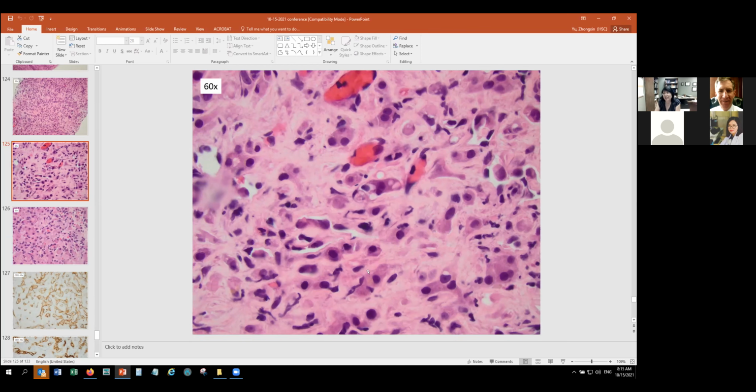For hepatocellular carcinoma, age is usually older, and there is also a background liver disease, cirrhosis. That's the clinical part. And hepatocellular carcinoma usually does not have that sky-high AFP, but does have AFP increase. But there's no immunomarker to differentiate hepatocellular carcinoma versus hepatoblastoma. It's purely by morphology.